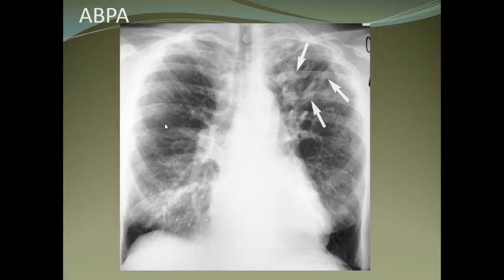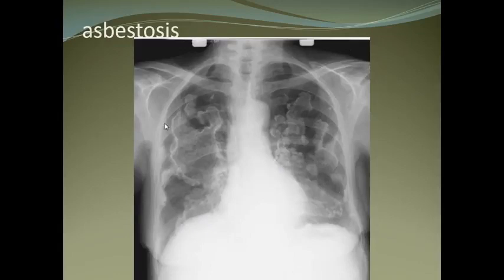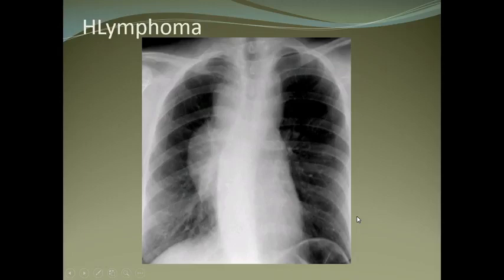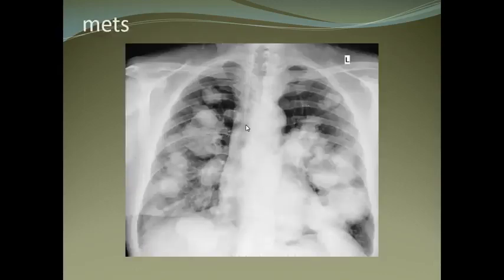Allergic bronchopulmonary aspergillosis shows a finger-in-glove appearance with multiple bronchoceles. Lung abscess shows an air-fluid level. Asbestosis is another finding. Lymphoma usually presents with enlarged hilar nodes.